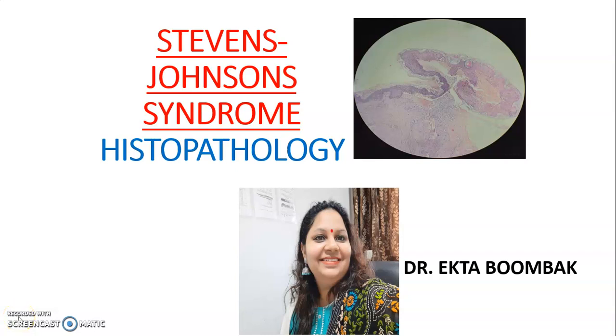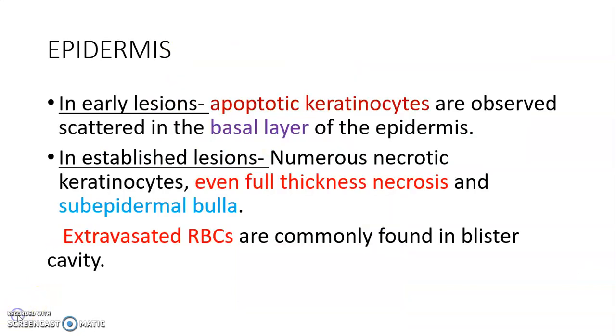Hello everyone. Today we are going to study histopathology of Stevens-Johnson syndrome. In Stevens-Johnson syndrome, we receive a skin biopsy. So what do we have to see in the skin biopsy?